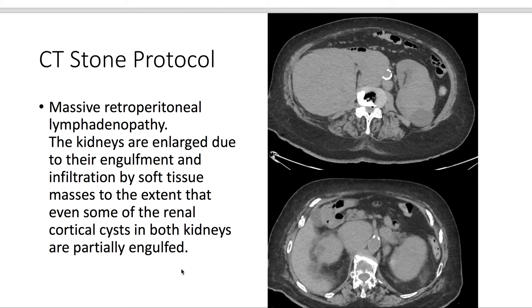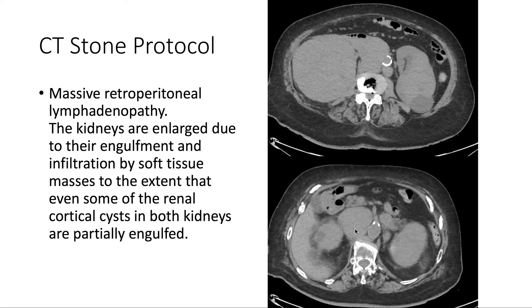Taking a look at the CT, we note massive retroperitoneal lymphadenopathy. The kidneys are enlarged due to their engulfment and infiltration by soft tissue masses, to the extent that even some of the renal cortical cysts in both kidneys are partially engulfed.